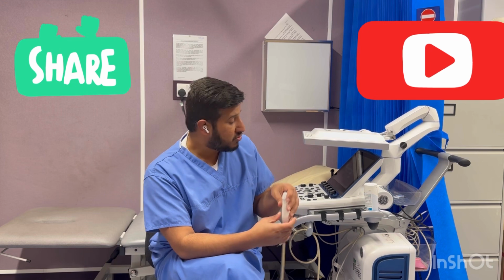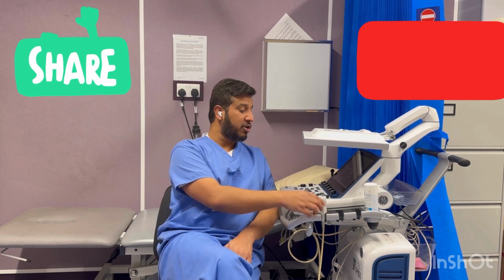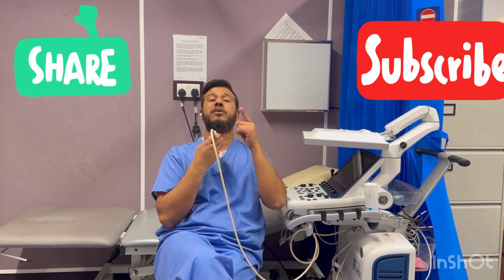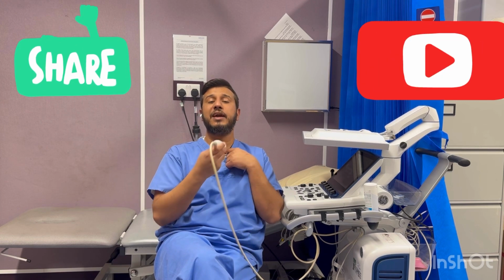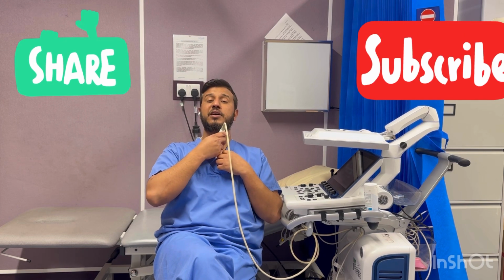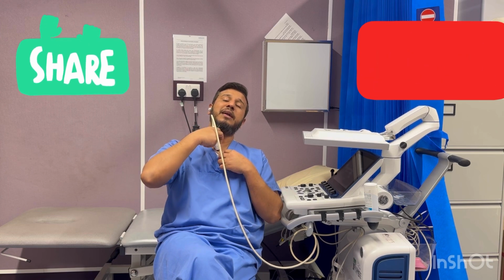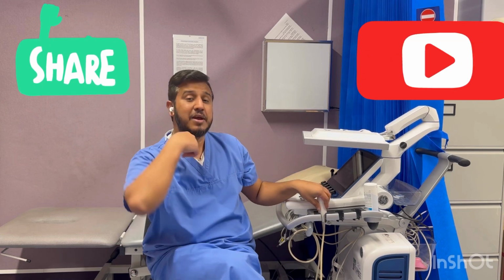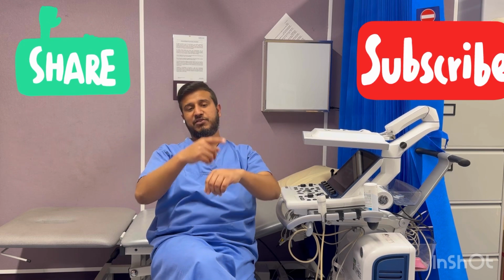Okay, so the next thing is the suprasternal window. You will go into the suprasternal notch, and the marker should be upside. Your marker will be at 12 o'clock and you will keep the probe this way. Again, your aorta is about here, and you are keeping the probe here, so you need to keep the probe slightly angulated, not straight, so you are sending the waves downwards. You need to be slightly this way so you can target the arch and descending aorta.